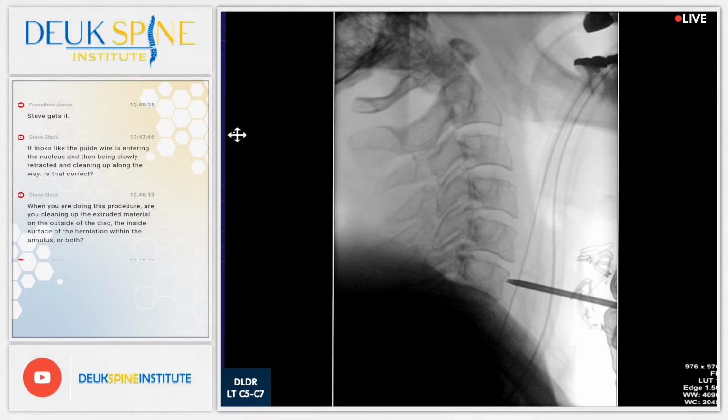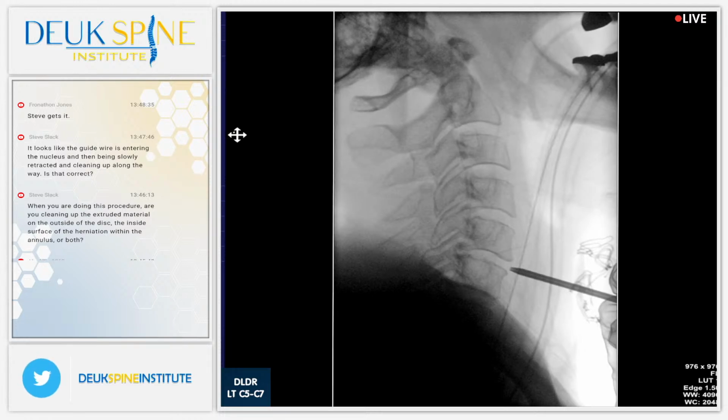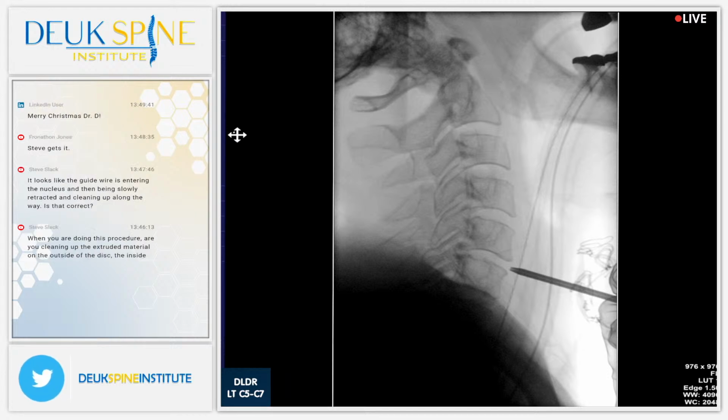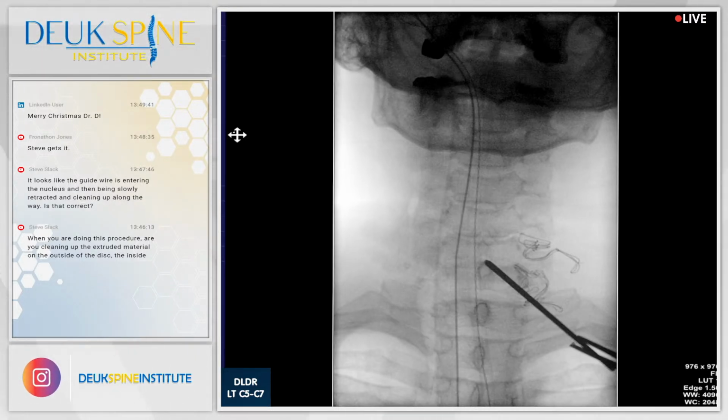Shot. And one more shot. I should be on the disc. I am. AP. I want to check my front back. Make sure I haven't slid to the left or right, because that would be catastrophic if I tried going in. All right, we're still in the middle. I could go just a smidgen to the patient's right. Shot. Lateral view. Well, come on, let's not hit the table.